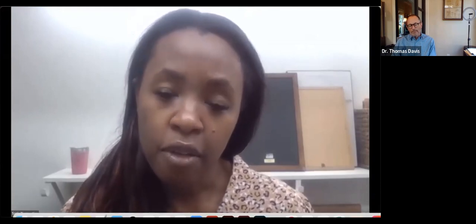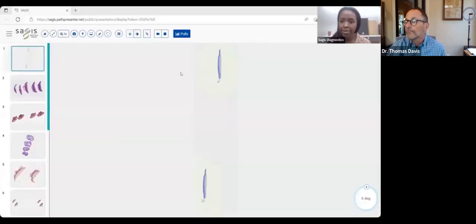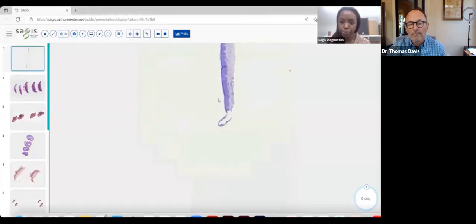I really want to deal specifically with the effect of a localized viral infection in the skin, and what we expect to see histologically, as opposed to the inflammatory dermatoses that can arise secondary to a viral infection somewhere in the system. That's a whole different topic. I'm going to start sharing my screen, and we might as well just jump right into the cases.